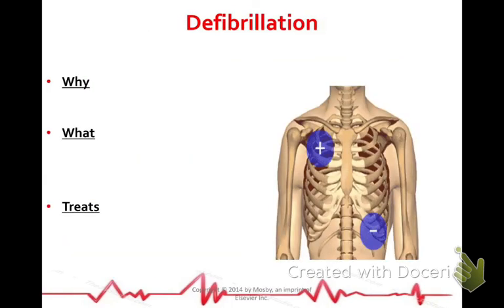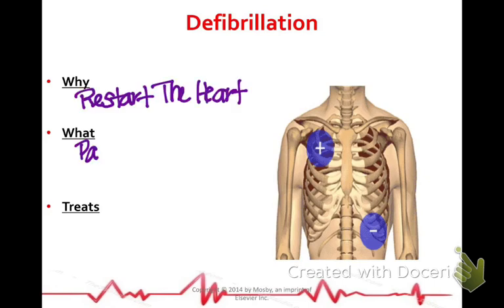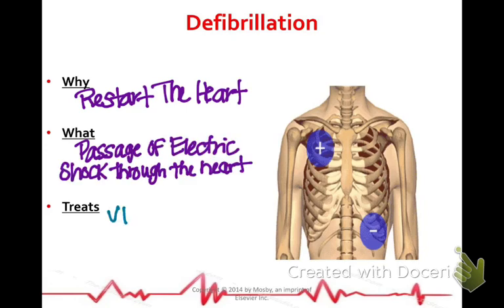So why do we want to defibrillate somebody? To restart the heart. So they're usually pulseless if they get defibrillated, right? So what is it? It's passage of electrical shock through the heart.